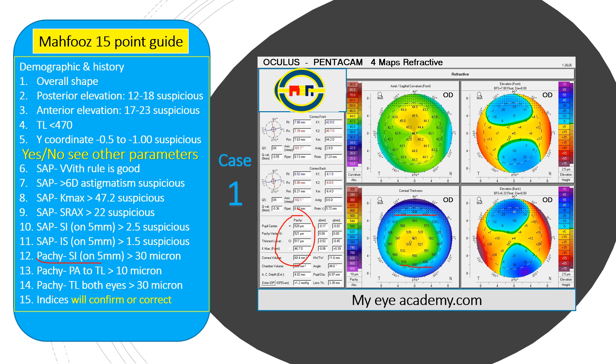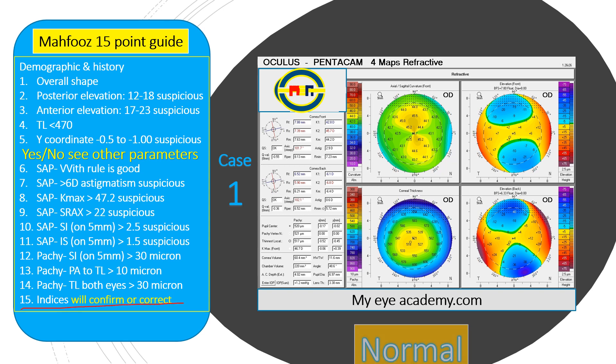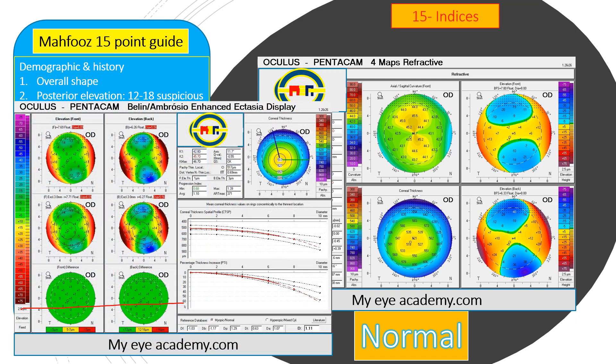Number fourteen: the thinnest location of both eyes is less than 30 microns difference. All the signs indicate that it is perhaps a normal cornea. Number fifteen — the indices: all the indices are white, not suspicious, confirming that it is a normal cornea. The first five points made it clear, the other points confirmed it, and the indices confirmed it is a normal cornea. Let's go to case number two.